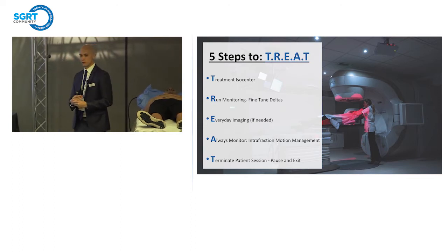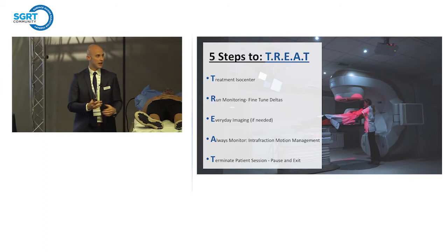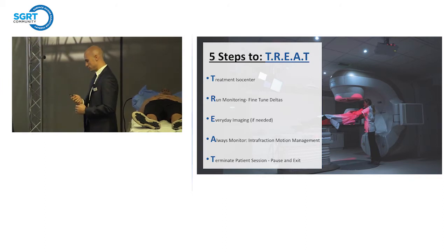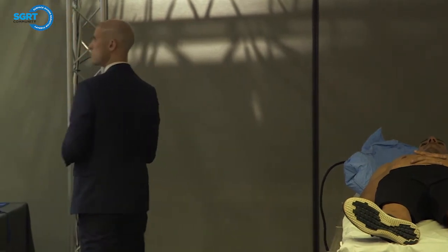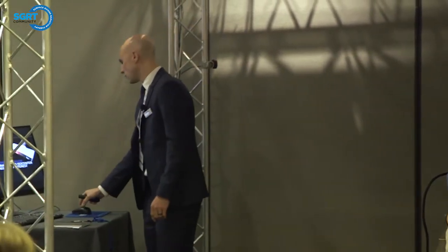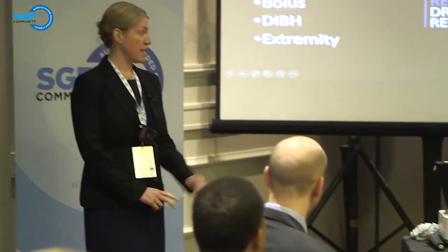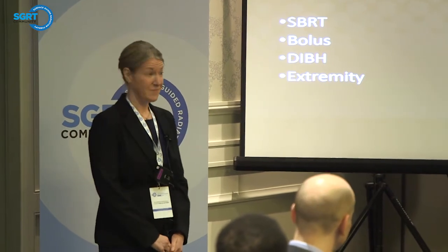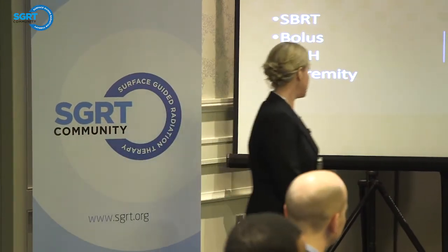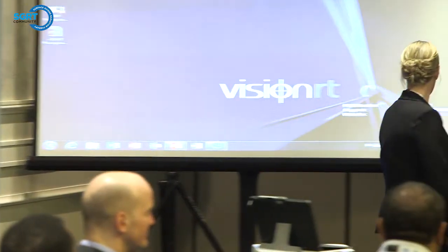There are a few treatment workflows that we're going to go over today, and let's talk about those. We'll be going over an SBRT workflow, chest wall with bolus, the deep inspiration breath hold along with the real-time coach, and also we'll be doing an extremity. Okay, so starting off with SBRT.